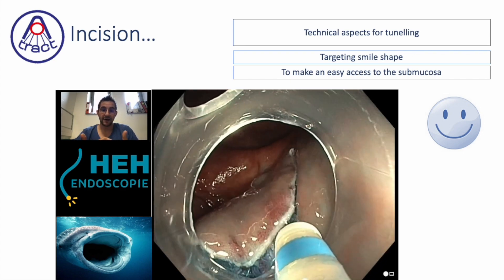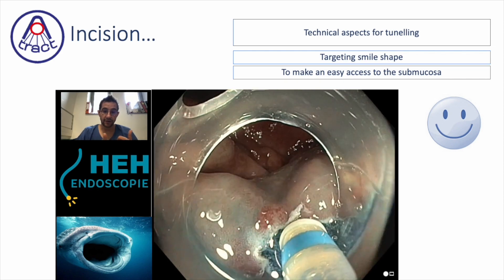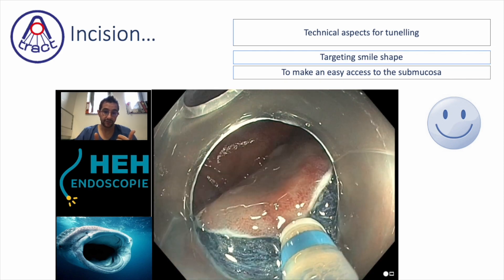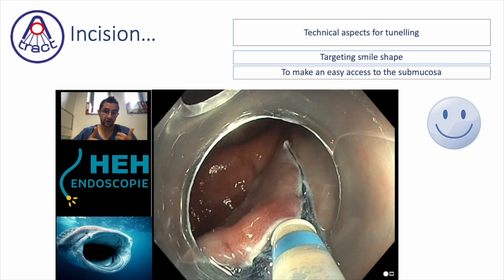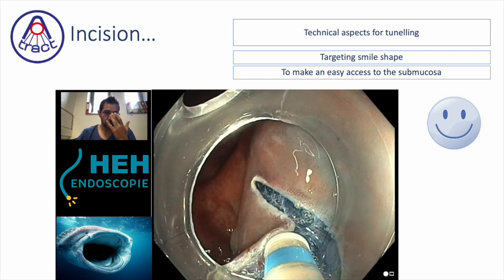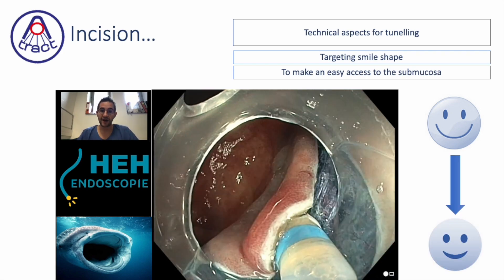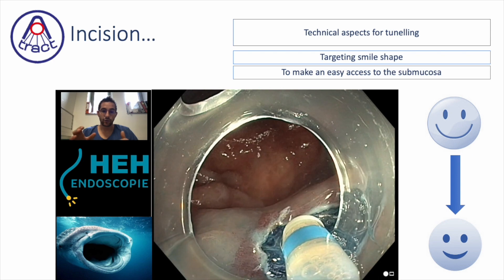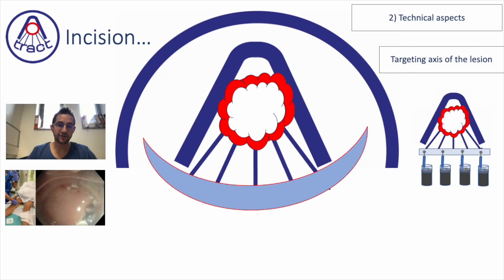Now we are doing the trimming — it means cutting the first fibers of the submucosa in order to enlarge the space. What you want to reach is the shape of a large smile, which is a kind of whale mouth, in order to enter with the scope.